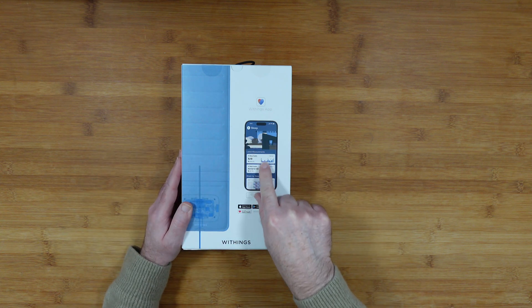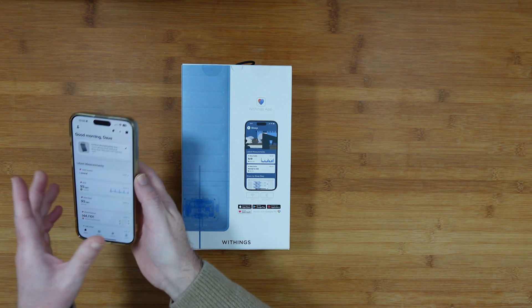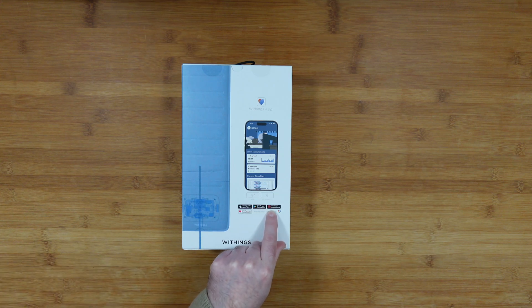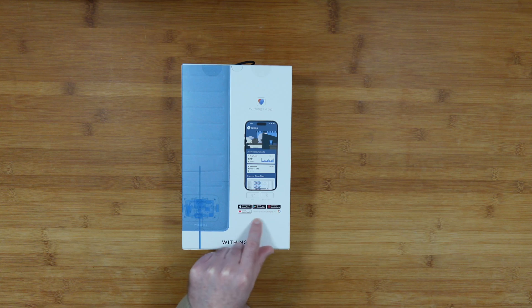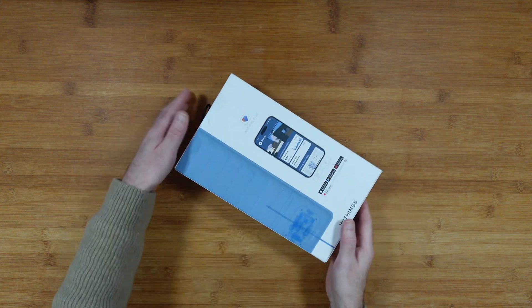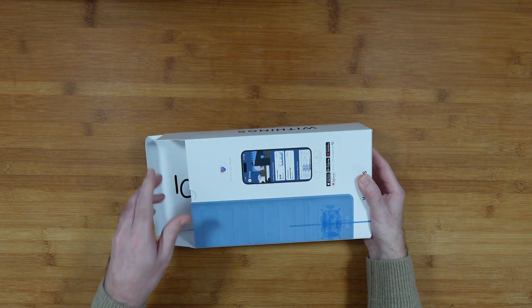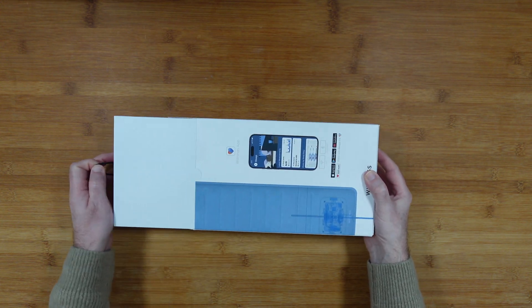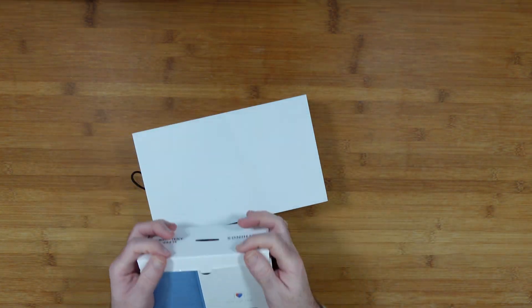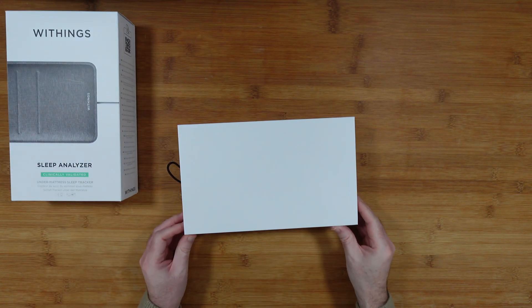The back of the box shows a picture of the app. I already have the app installed on my phone as I use other Withings products. The app is available on the iOS App Store, Google Play Store, and App Gallery. It integrates with Apple Health and Google Fit, which is really nice — in my case I can share data with Apple Health and analyze it to potentially improve my sleep pattern and experience.